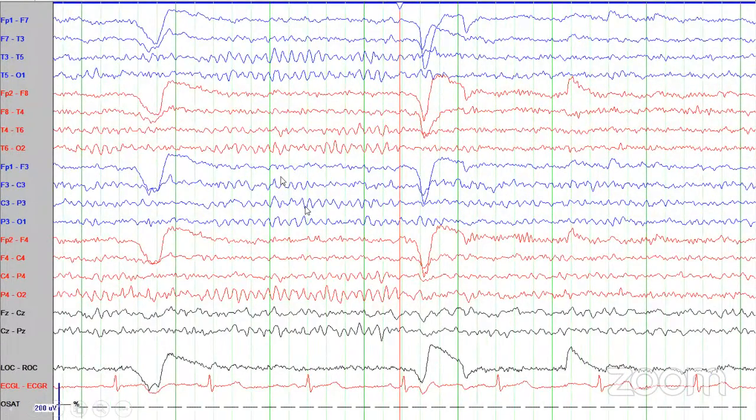Now, the second point that we spoke about was that this well-established anteroposterior gradient gets attenuated when one opens his or her eyes. So let's see, how do we know when the eye is open and when it is closed? In this epoch, this mid portion is where the background appears to be most beautifully organized in an anteroposterior format. Here, these are the ocular electrodes, and in this particular recording they are placed just close to the frontal electrodes.